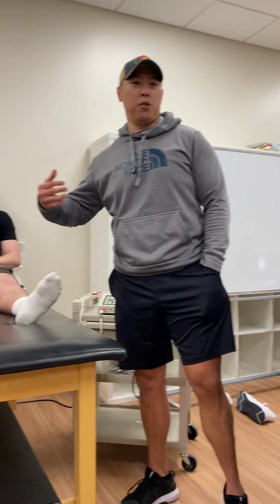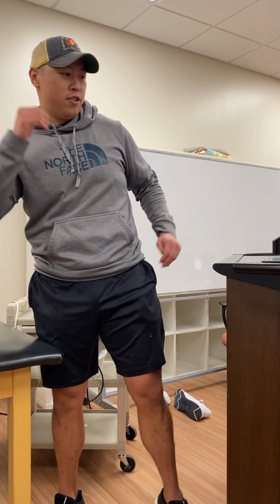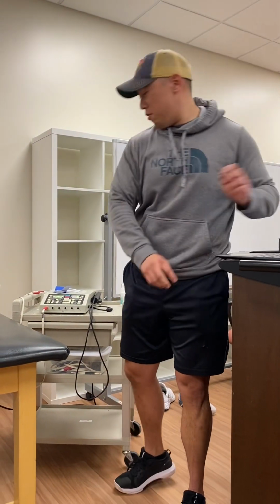So today our patient is going to be Brandon. He's 18 years old. He recently had a right ACL reconstruction. So we did a little bit of testing already. He's having trouble activating his quads, and when he performs a straight leg raise, he's having a little bit of extensor lag. His pain levels are pretty minor right now. He reported a 1 out of 10. So today we're going to be performing a biphasic estim, and it's going to help with quad strengthening and neuromuscular re-education.